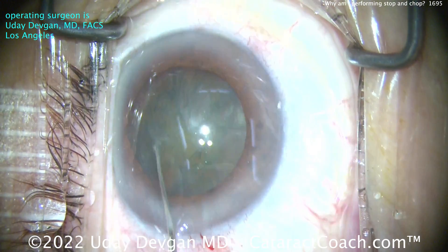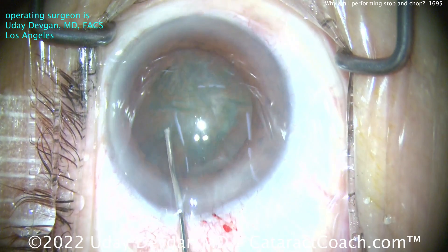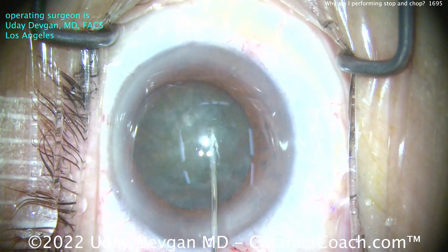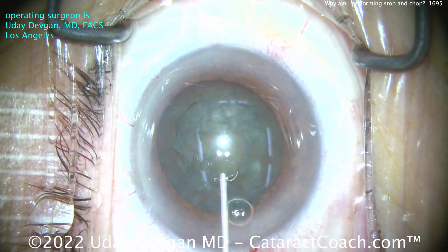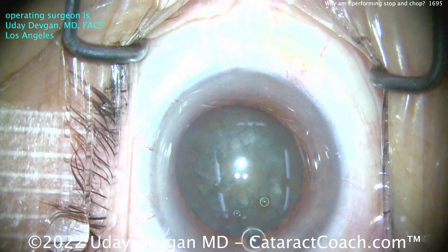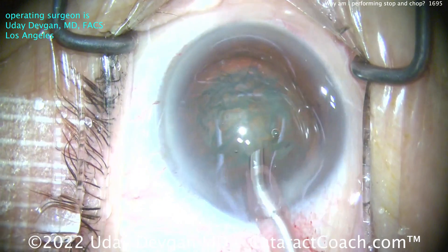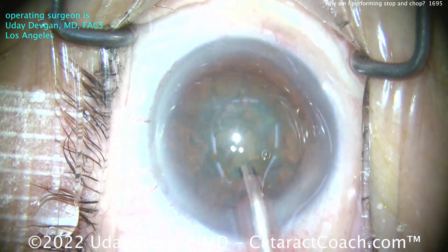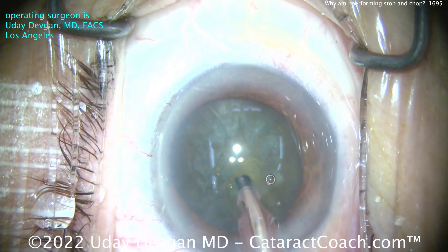Yes, I love FACO chop. I want you to be a FACO chop master. When you do a FACO on my eye with a normal AC depth, I want you to do FACO chop. But in a case like this, where it's a tiny eye with a shallow anterior chamber and a hyperopic eye, I want to do FACO stop and chop. Watch this — look at the probe. I don't go bevel down, I go bevel up.